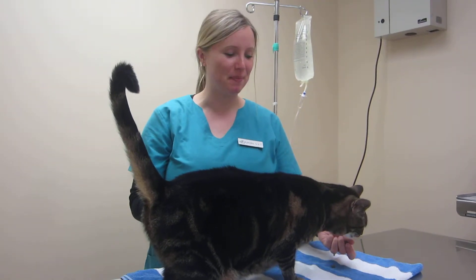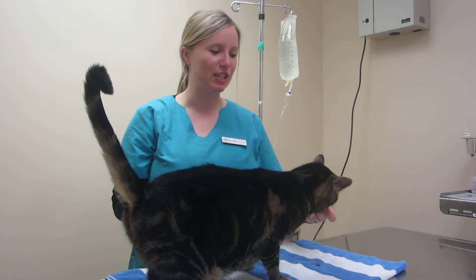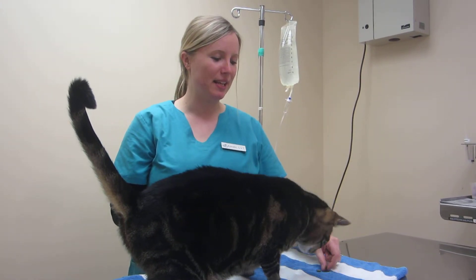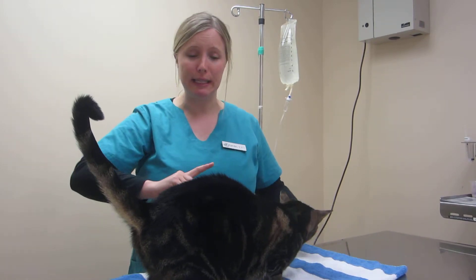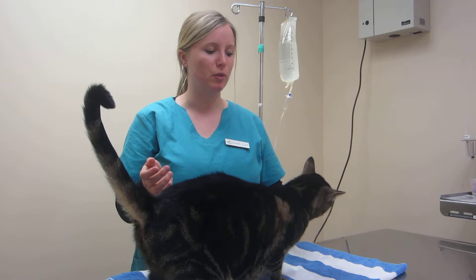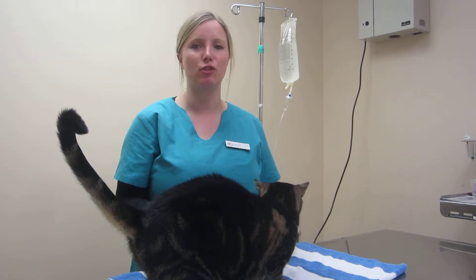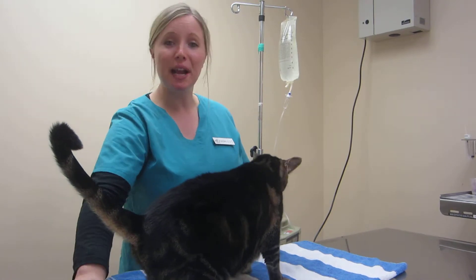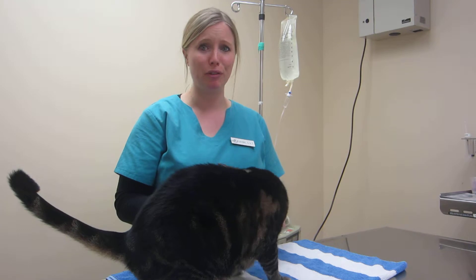Welcome to Part 2 of Subcutaneous Fluid Administration. This is Enzo — he's our star today. He's one of our Vet Tech students' cats, and he's super friendly, but he is a little wiggly, so we figured he's a great example to use in our video, because most of your cats probably aren't just going to sit there like statues. They're probably going to try to get away. So the first thing I'm doing is giving him treats, just so he is not fearful of what we're going to do.